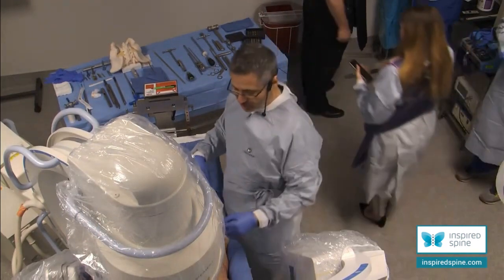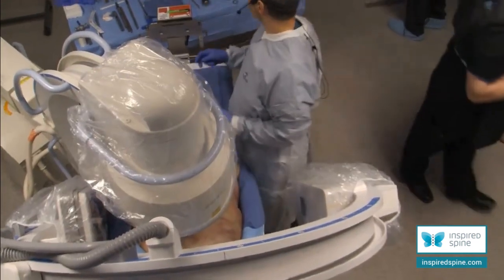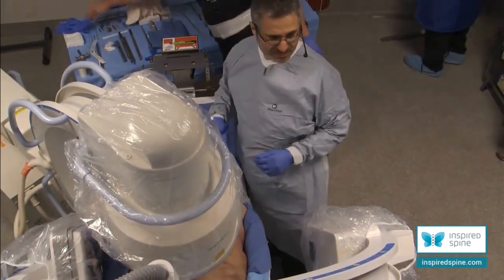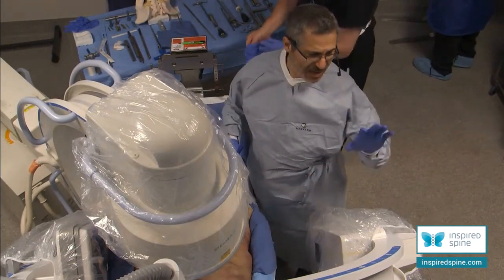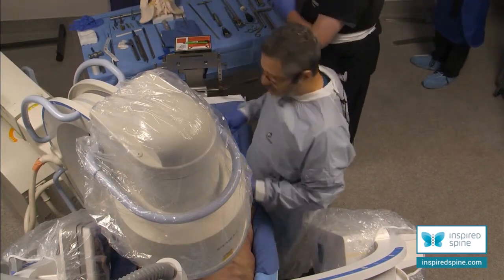Good, good, good. Then let's just do the procedure. Okay, is everybody ready? Ken? Yes, sir. Ready? Ready. Okay, I have my pictures. I'm going to do an L3 for OLIF. Let's start. Time start.